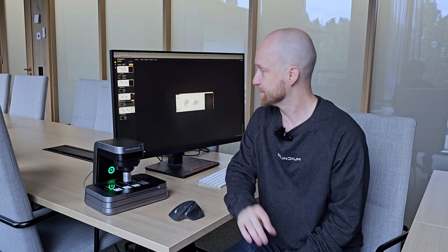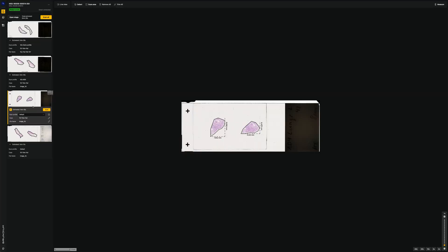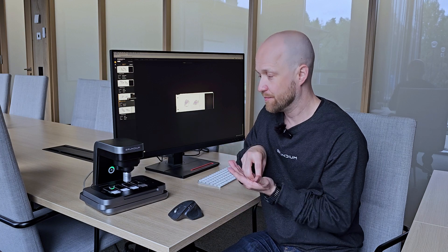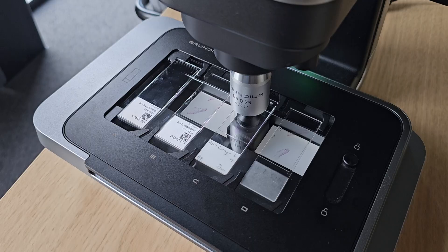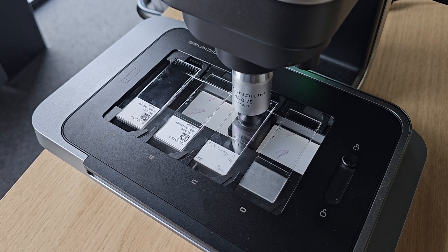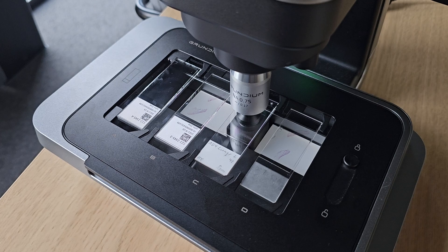So let's proceed with scanning. Let's scan slide C. That will take a bit over a minute and a half. And we just hit scan. And then the scanner starts moving and taking pictures of the area that we have chosen.